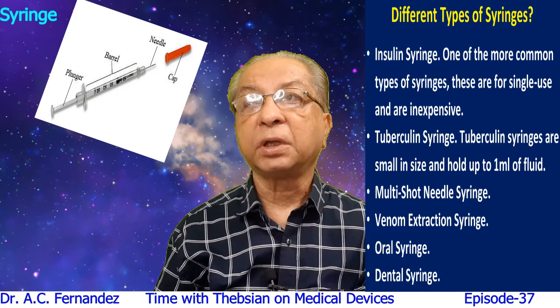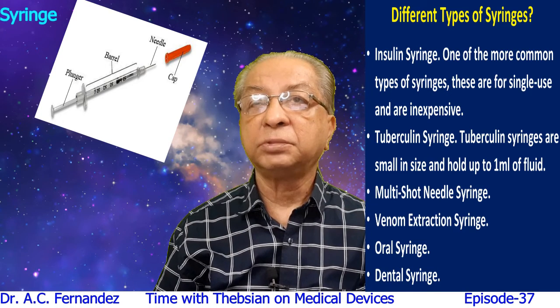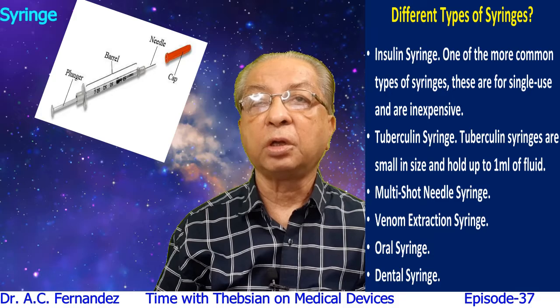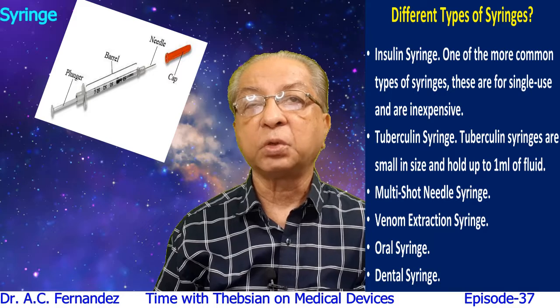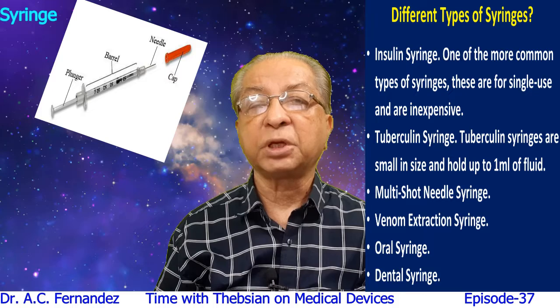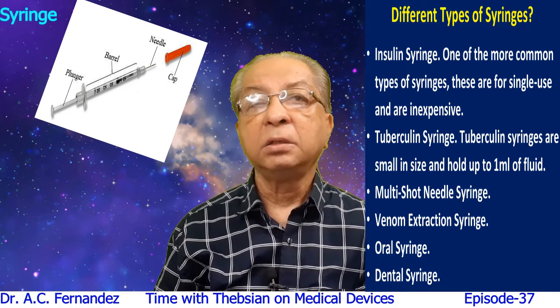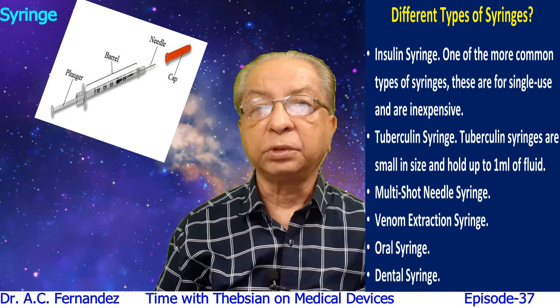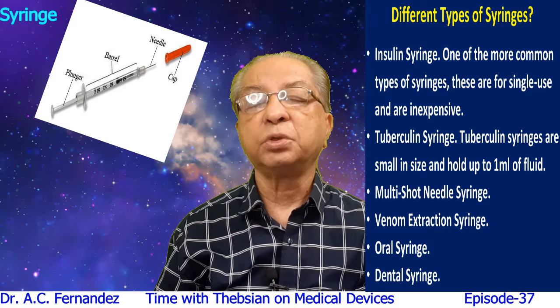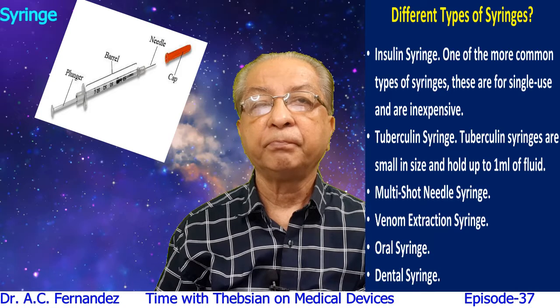Venom extraction syringes are different from standard syringes because they usually do not puncture the wound. The most common types have a plastic nozzle which is placed over the allotted area, and then the syringe piston is pulled back, creating a vacuum that allegedly sucks out the venom in the place of the wound. This syringe is used in the treatment of snake bites.